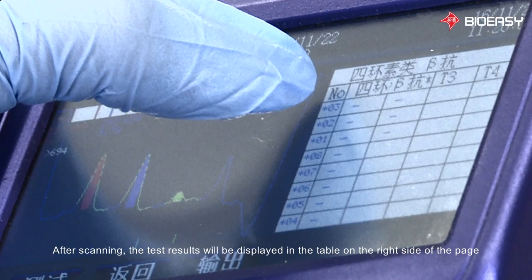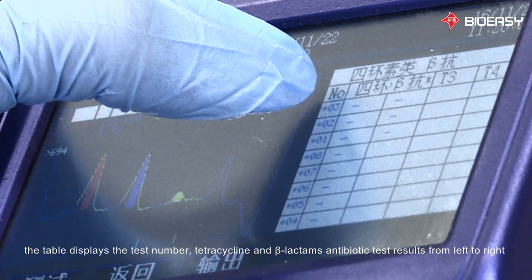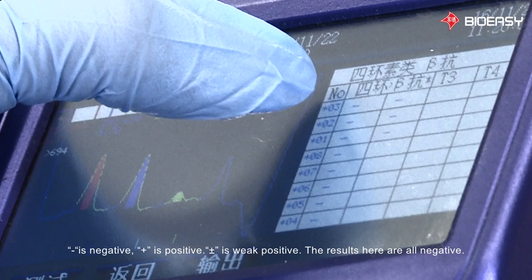After scanning, the test results will be displayed in a table on the right side of the page. The table displays the test number, tetracycline, and beta-lactam antibiotic test results from left to right. Minus is negative, plus is positive, and plus-minus is weak positive. The results here are all negative.